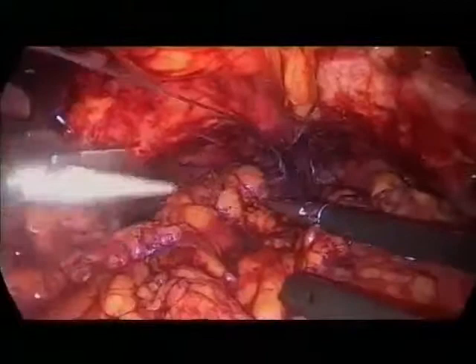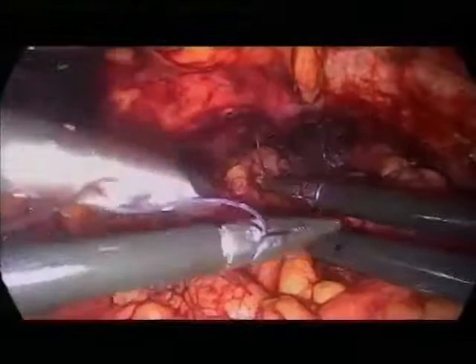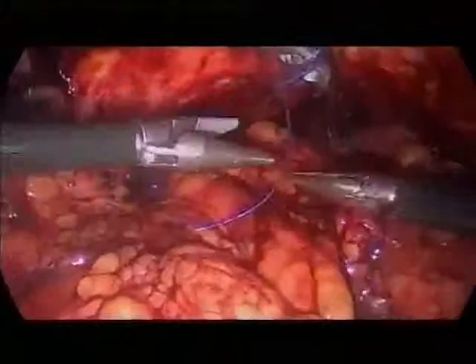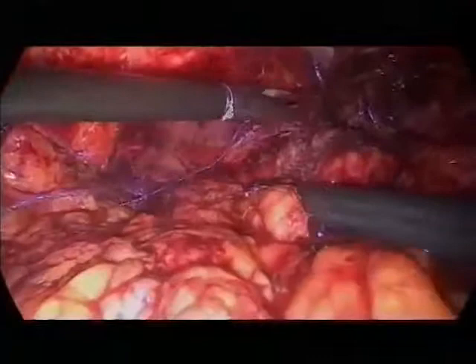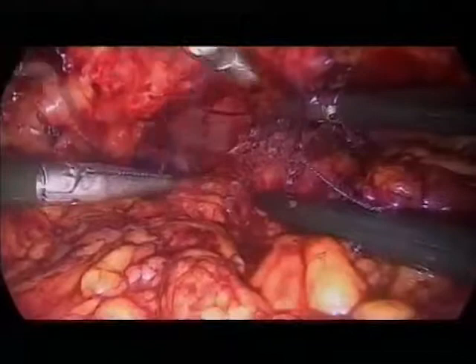What about the tension on this? Are you really fixing it like Marshall-Marchetti, or is there a little tension? Is this a loose one? No, it's not a loose one. It's a little tension on it. But as I said, we're doing a randomized study to compare if it really makes sense. Okay, you see, and now the assistant grasps the knot, so there's a little tension. Yeah, the assistant is perfect today.